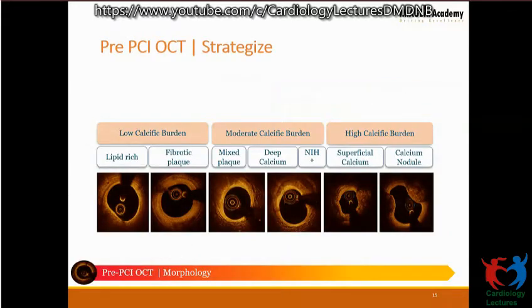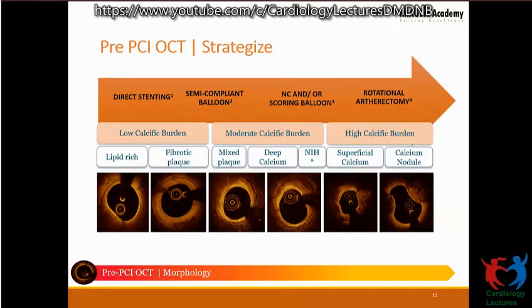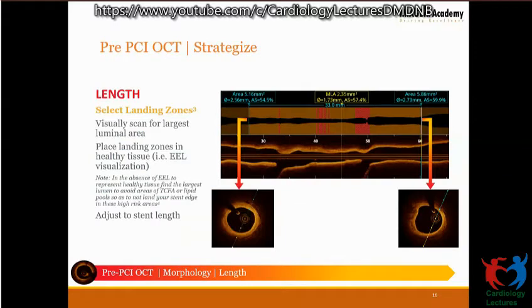So in general, when we are strategizing, let's see the spectrum. You can have some moderate or high calcium. If it is low calcium, you have a lipid and a fibrotic plaque. With moderate calcium, you still will do angioplasty without atherectomy devices. So this is how it goes. As the amount of calcium increases, you need more atherectomy devices. You need to go to rotational atherectomy, and IVL is another tool which is very friendly and ablates the calcium in a manner that gives you very optimal stent expansion.